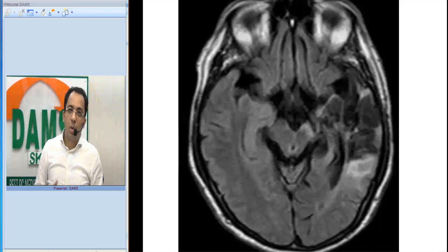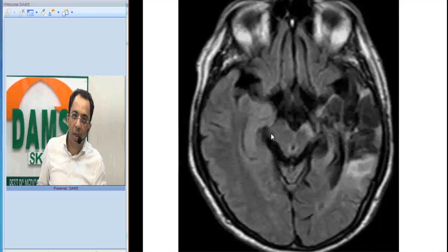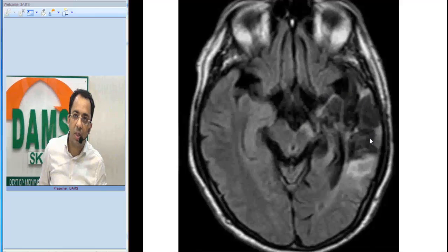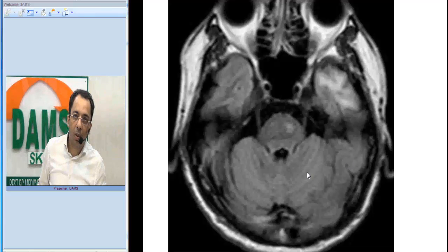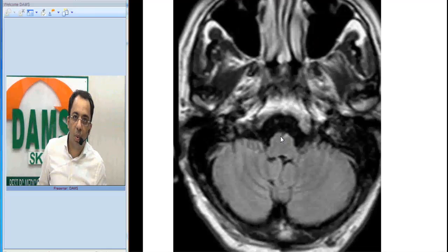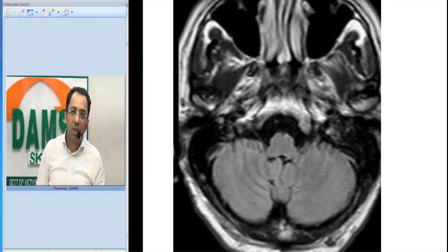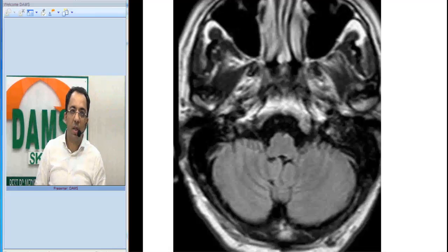As we go down this MRI, this is the area of the midbrain — you can see the cerebral peduncle on the right side. Look at the cerebral peduncle on the left side; it is atrophied with FLAIR hyper-intense signal. Going further down, there is FLAIR hyper-intensity even in the left pons, and slight flattening of the medulla with some hyper-intensity here. These findings are suggestive of Wallerian degeneration in the pyramidal tract, secondary to the left MCA territory old infarct.